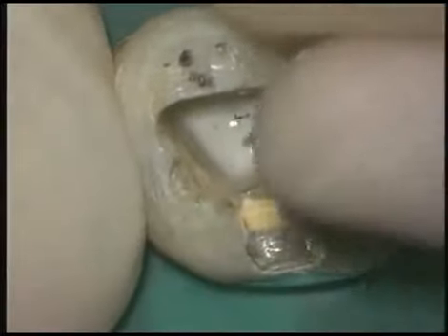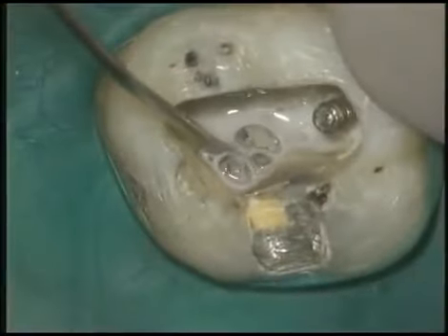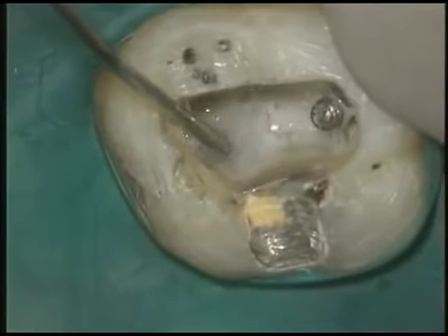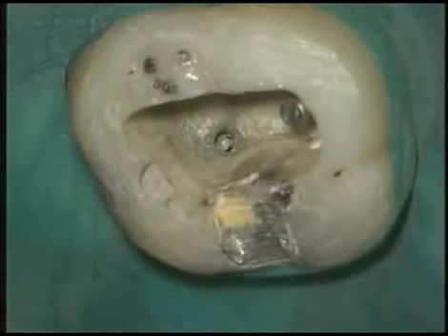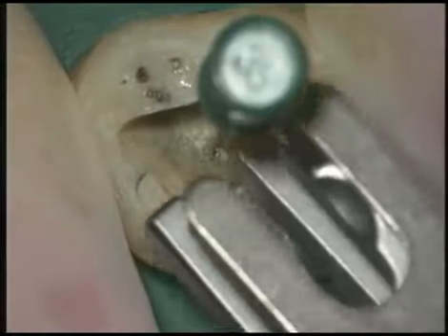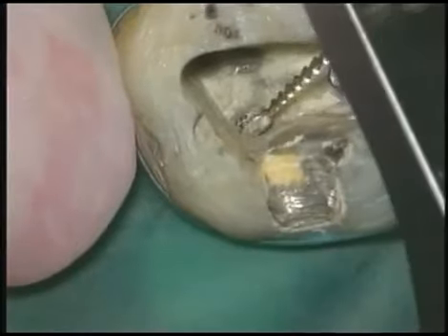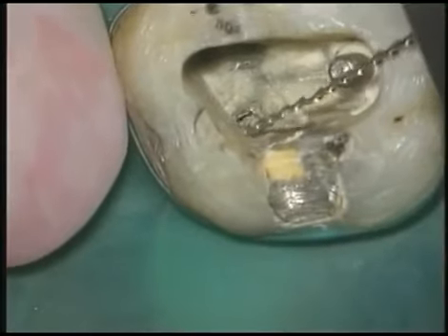The 15 file is inserted. Again, the short picking motions encourage more dissolution of sealer. Flush, aspirate, flush, aspirate. This gives us great vision. At high mag, we can see how really exposed this silver point is. This will allow a 35 Hedstrom to be placed in the canal. Its cutting flutes will firmly engage the soft elemental silver. The extracting plier from the post-removal system is mounted, and by turning the screw knobs, the arms progressively open, and this force elevates out the silver point.